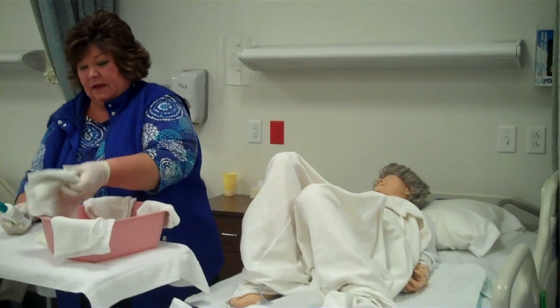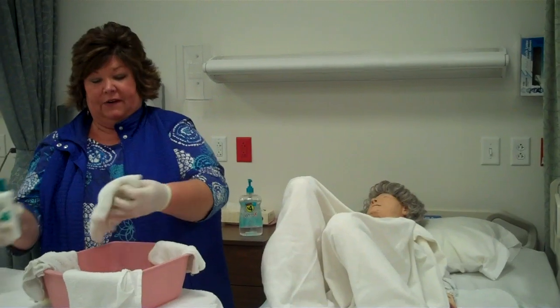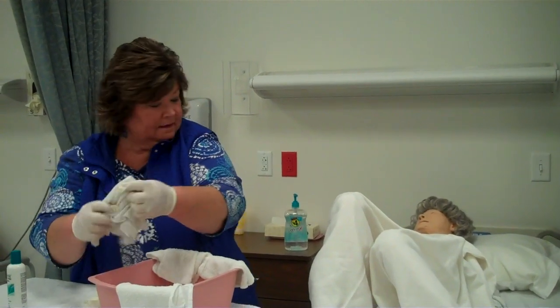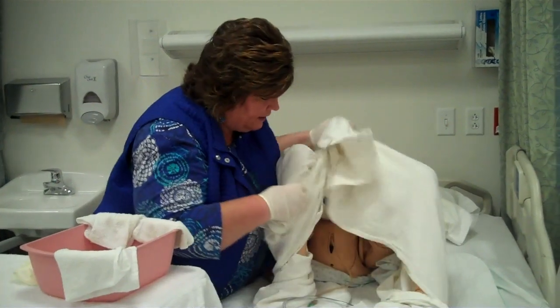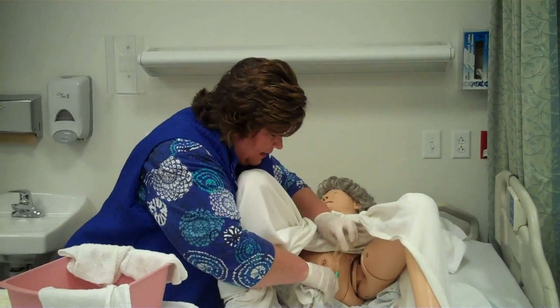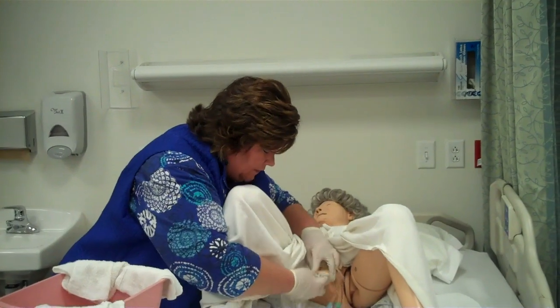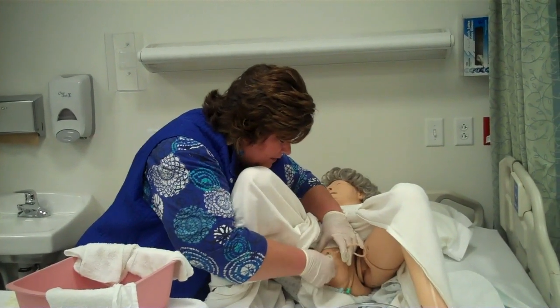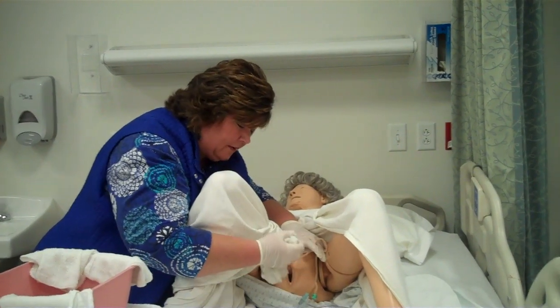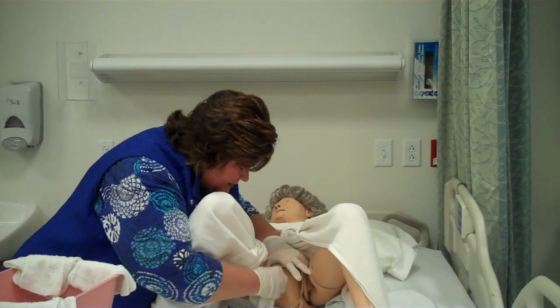So now I'm going to soak up two washcloths. I'm going to soak the corners of the first one as well as the four areas in the middle. This is going to wash around the urinary meatus as well as pericare. The next soapy washcloth is going to be for the tube itself. Mrs. Smith, you're going to feel me touching you here. I'm going to wash around the catheter and we'll try and be gentle. With my index finger and thumb I'm separating the labia, and with my ring finger and middle finger I'm holding the catheter so that we're not tugging on it.